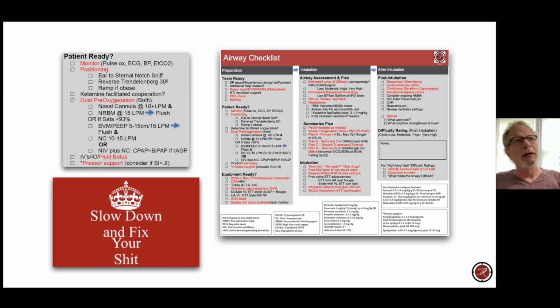So you're going to have your nasal prongs on underneath your non-rebreather. And the non-rebreather, yes, it goes up to 15 liters, but it can go up to much higher than that. And the term we use is flush rate. What flush rate means is that we're cranking up the dial beyond that 15 liters. It'll make a hissing sound like a plane's about to take off, and you'll be able to deliver upwards of 60 liters per minute.